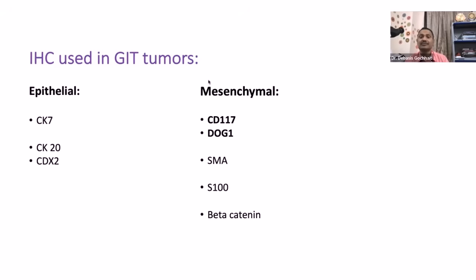Then we will talk about some mesenchymal tumors, right? Mesenchymal tumor that is common in this. Can you name some mesenchymal tumor? Now MBBS, this is covered as an important one. Mesenchymal tumor that happens in the stomach, that is very common. That is GIST, okay? Gastrointestinal stromal tumors.